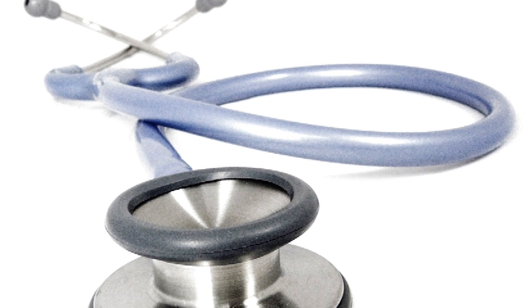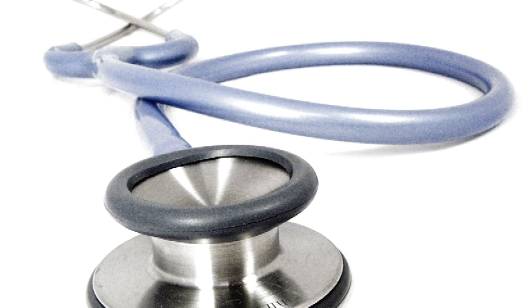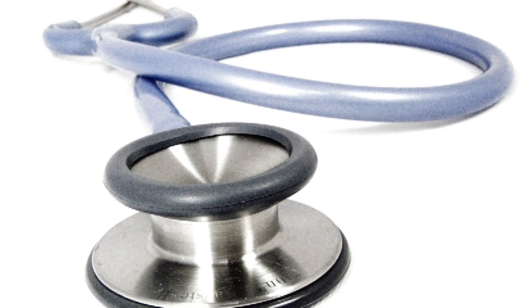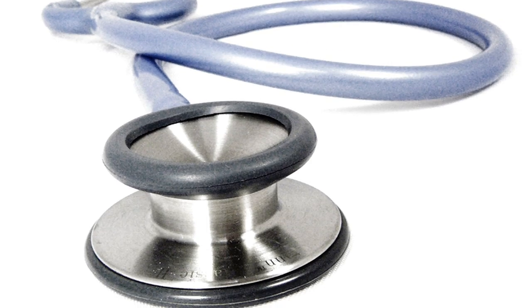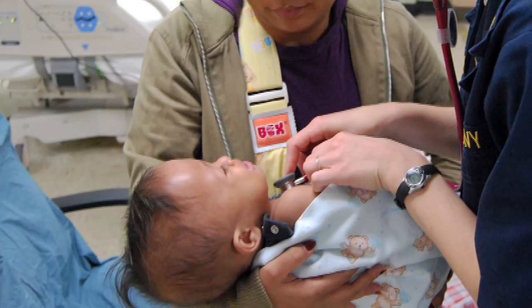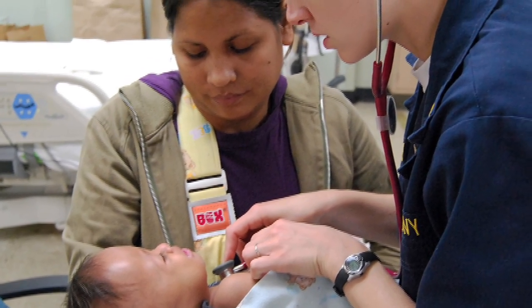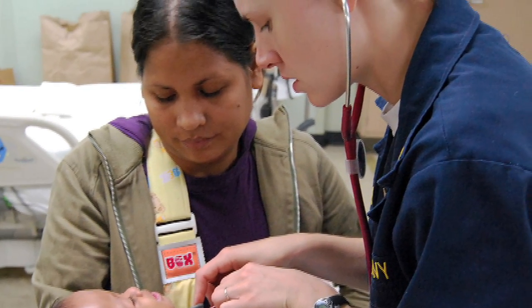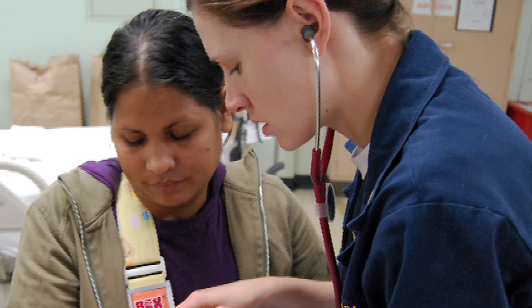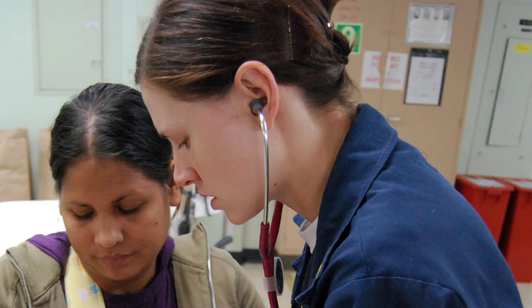The iconic stethoscope is nearly 200 years old and has barely changed in that time. As a frontline diagnostic tool for detecting heart trouble, the traditional model relies heavily on a doctor's ears and judgment.